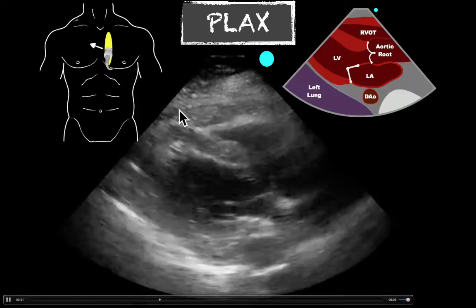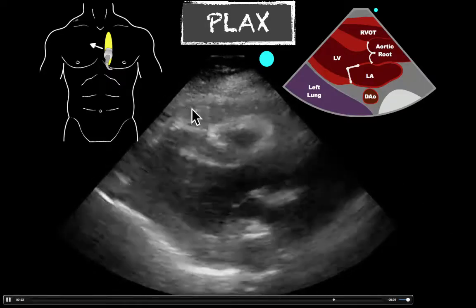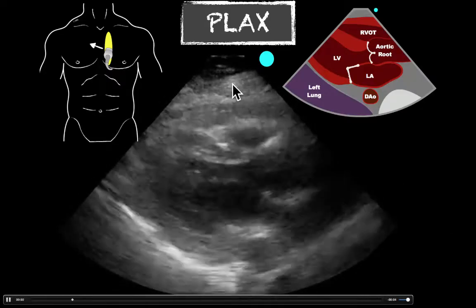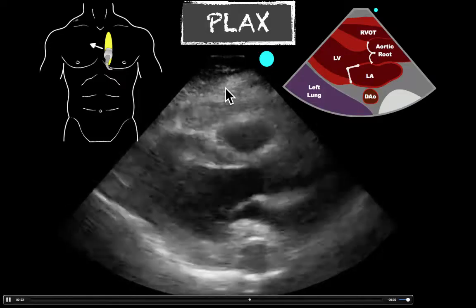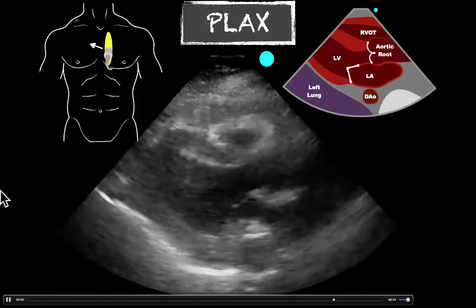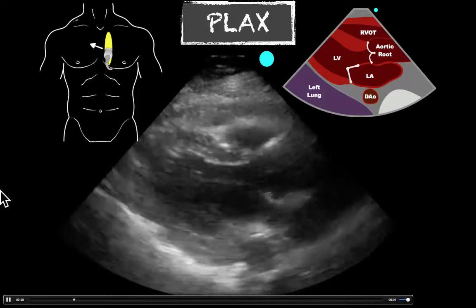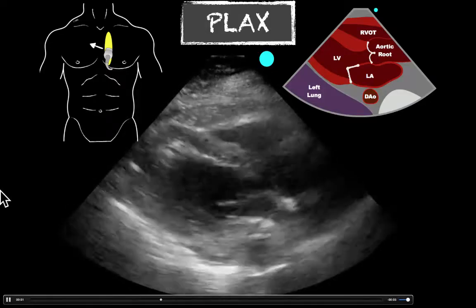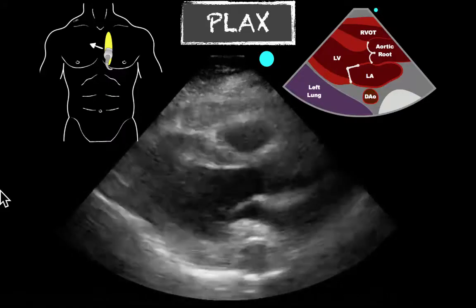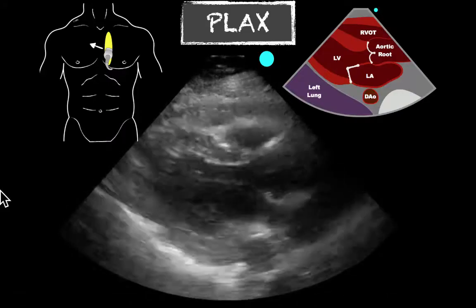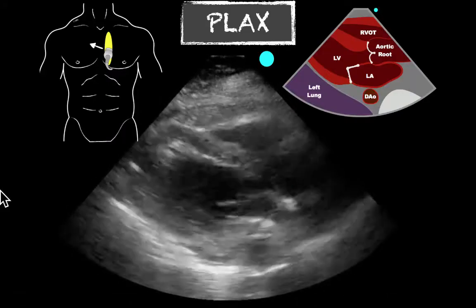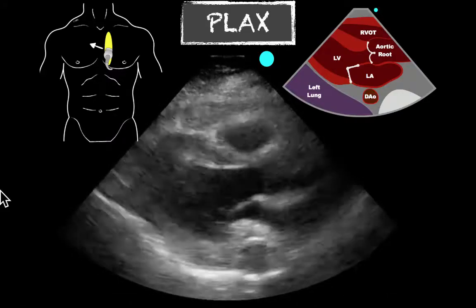All we see here is this echogenic area, which also looks the same as the subcutaneous tissue of the patient. This is what they were originally concerned was a pericardial effusion. And in this case, it's an epicardial fat pad.